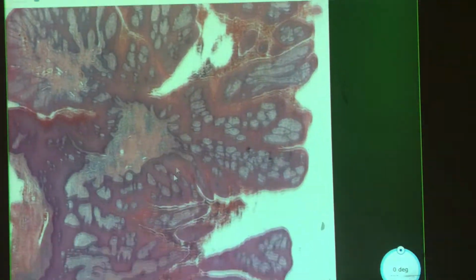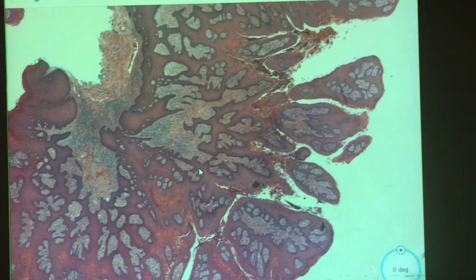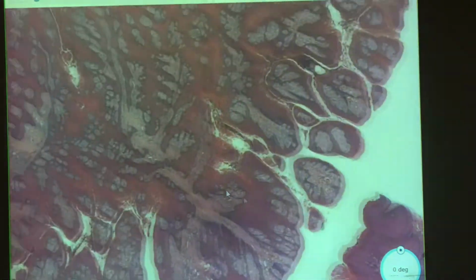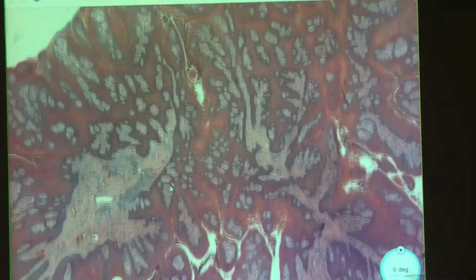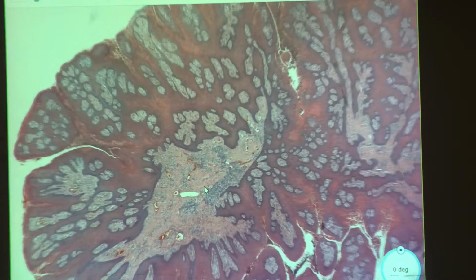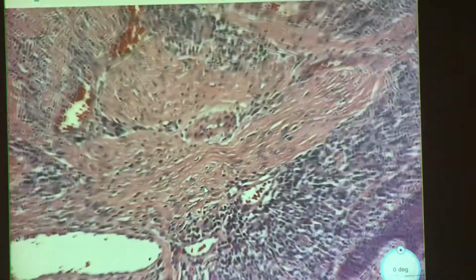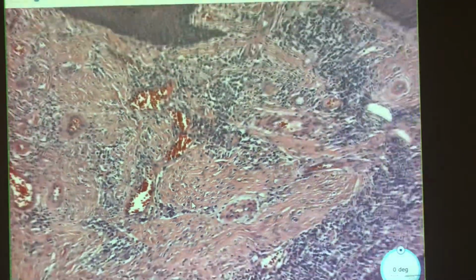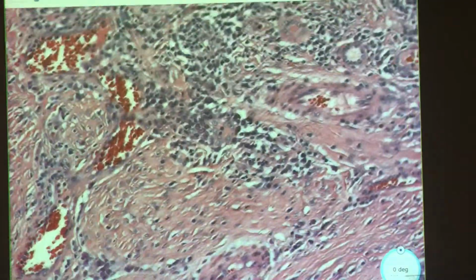Sure. And then, I have a feeling that you had a specific entity in mind that you were trying to see if it fit. And I want to say that you were probably thinking of, is this a verruca or a wart? But what are we kind of missing for that?